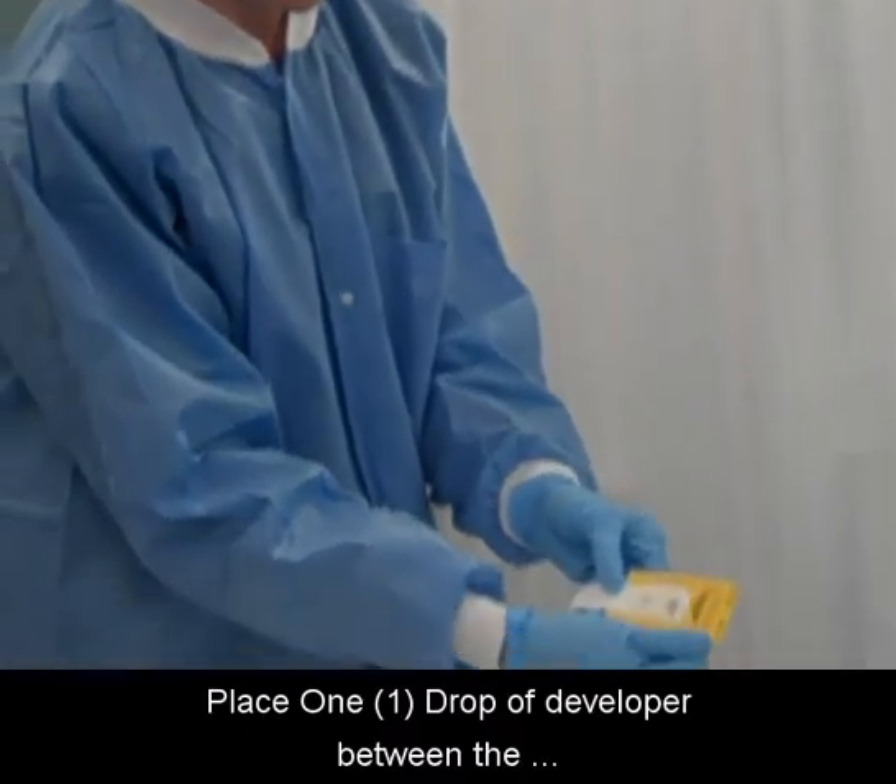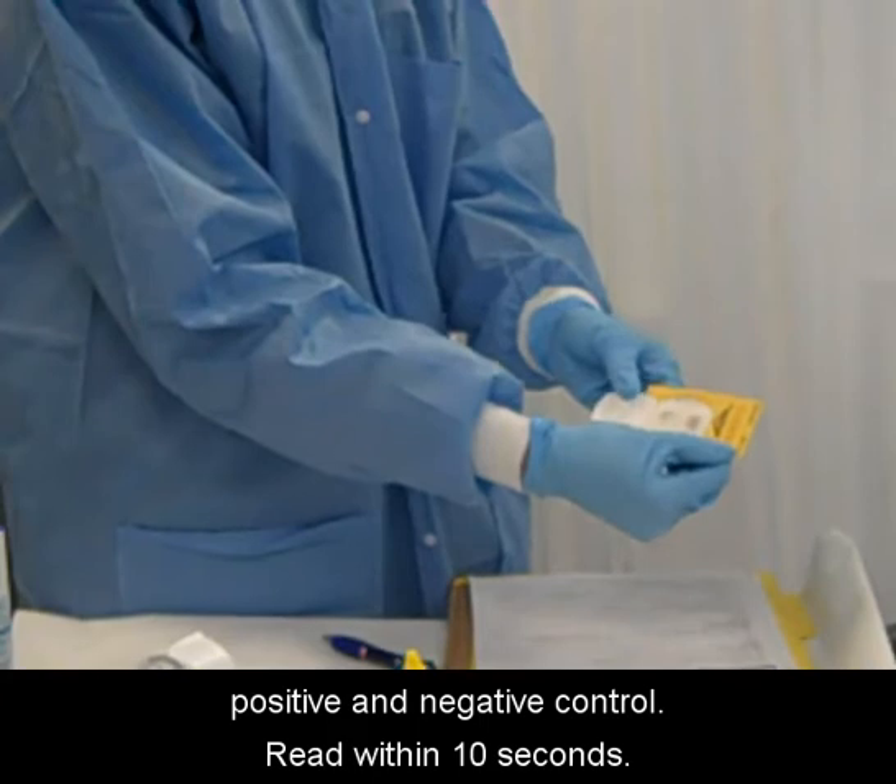Place one drop of developer between the positive and negative control. Read within 10 seconds.